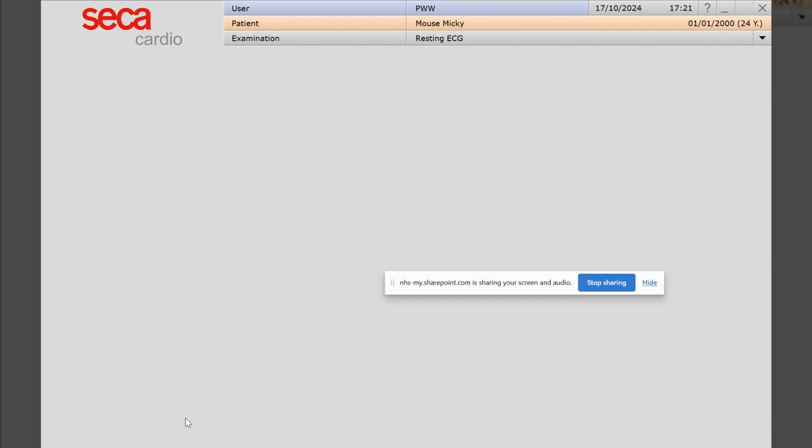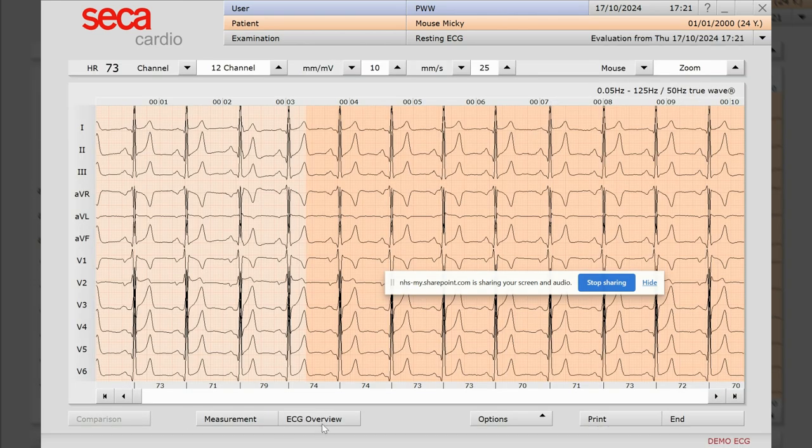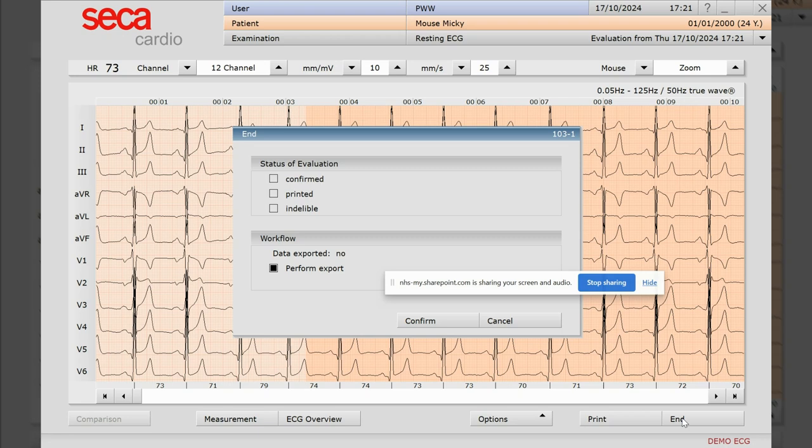And then that's it, you're all done. That's closed away now, so we can hit end on there and confirm that.